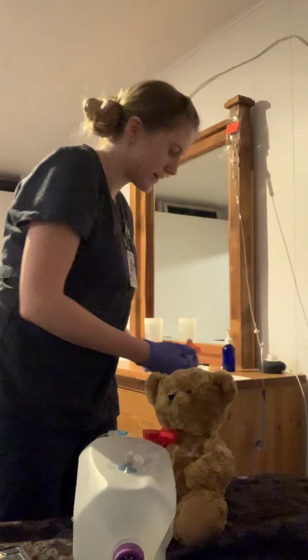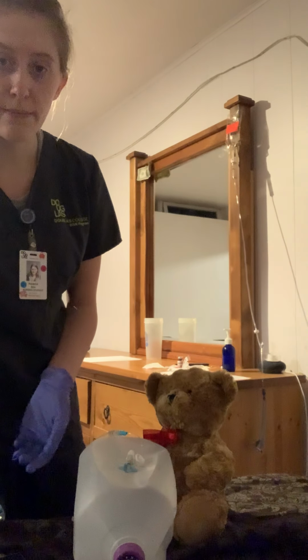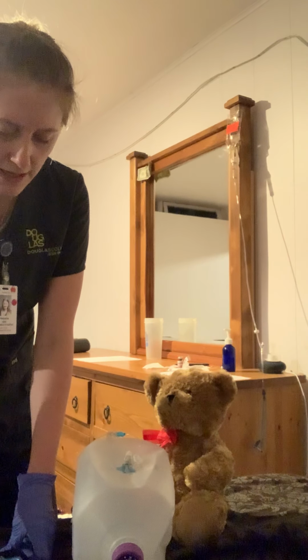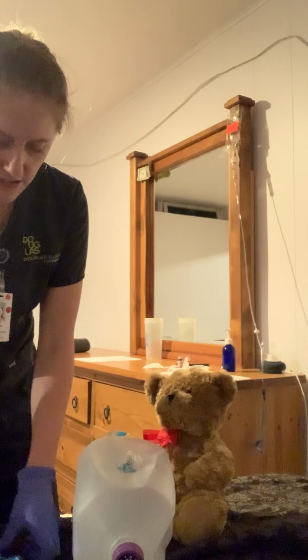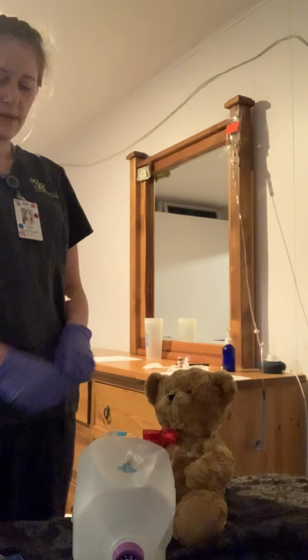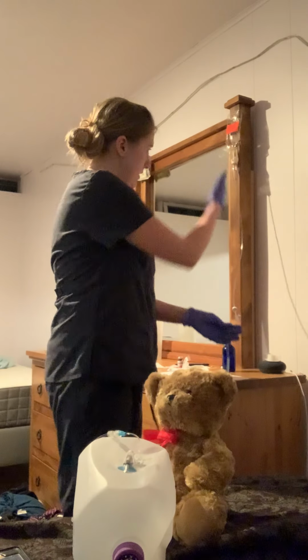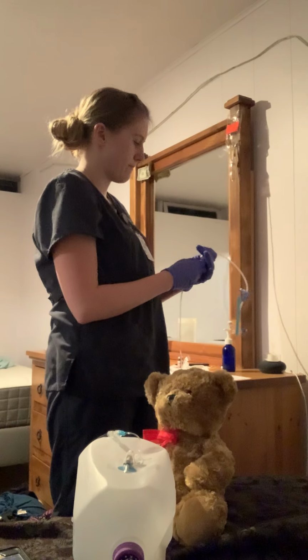So that is my checks. Put that here, and again, I'm also doing this 1 mil every 15 seconds. I have it on my syringe. I also have my timer in the room. So I'm just gonna set my timer here. This is stopwatch. Because the solution is incompatible, I would stop the Alaris, but in this case, I'm gonna close my line here.